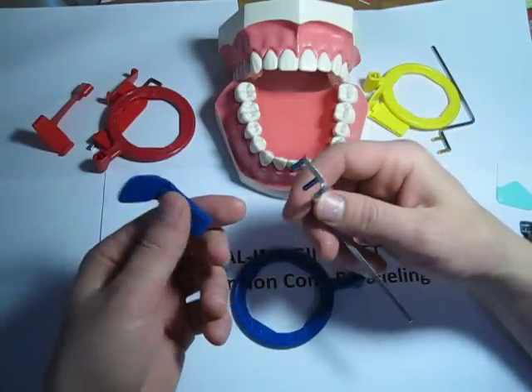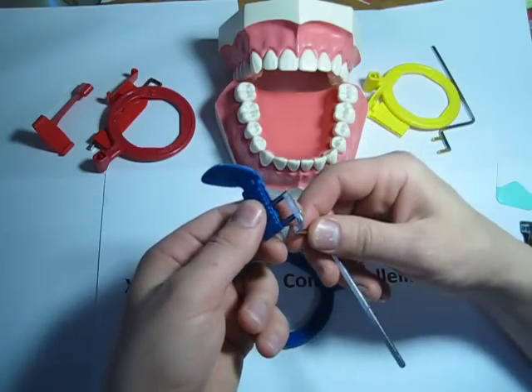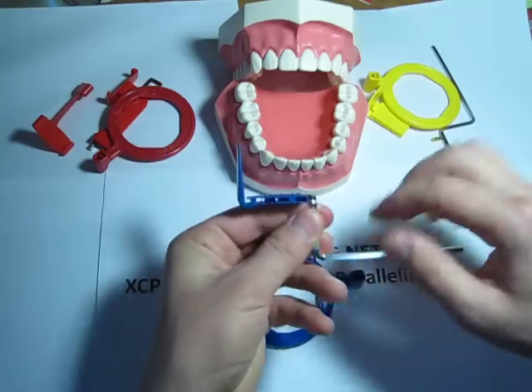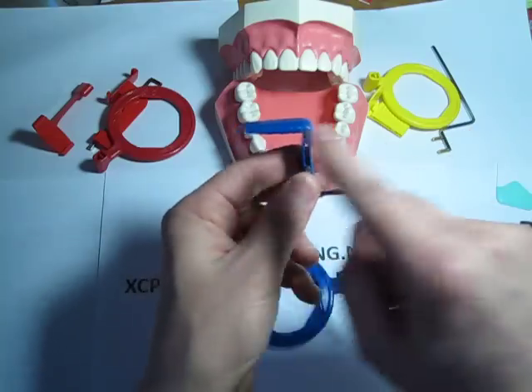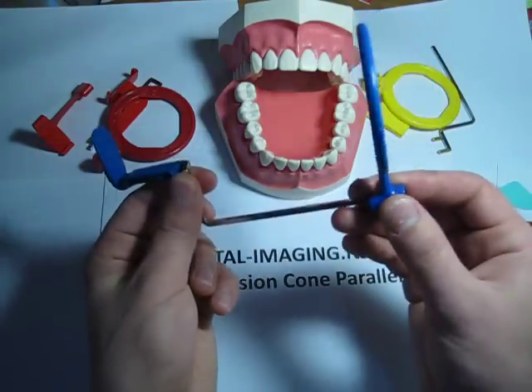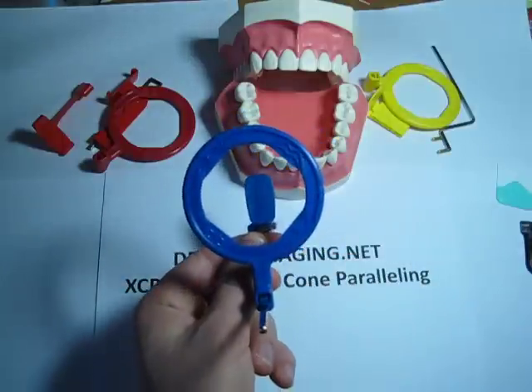The easiest way to assemble it is to first put together the bite block and the metal rod. When assembled, you want it to look like a chair formation — some people call it steps — like this. Then you put the ring on in such a way that when you look through the ring, you can see the bite block in the middle.